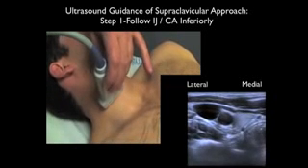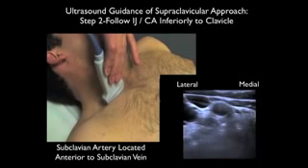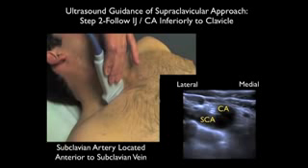Now let's go over how to use ultrasound to visualize the subclavian vein. We'll begin by running the probe down the neck to identify the internal jugular vein lateral to the carotid artery. We can push down with the probe to differentiate vein from artery, as the vein should completely compress as long as there's no thrombosis present. We can also use Doppler flow to differentiate the two vessels. After identifying the internal jugular vein, we'll run the probe further inferiorly and angle it down into the chest.